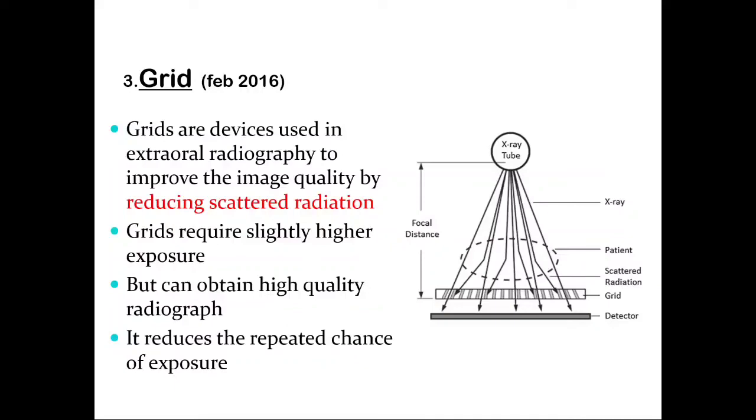Grids are used in extraoral radiography, wherein they help to improve the image quality by reducing the scattered radiation. So it reduces the chance of repeated exposure. That is why grids are utilized in extraoral radiography. So this is a diagram for grids.